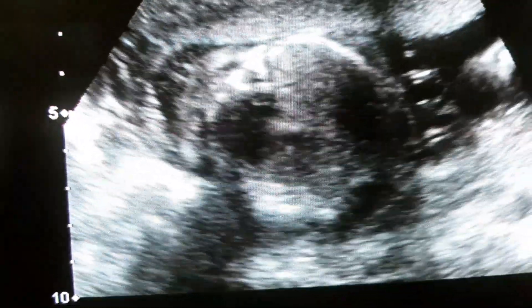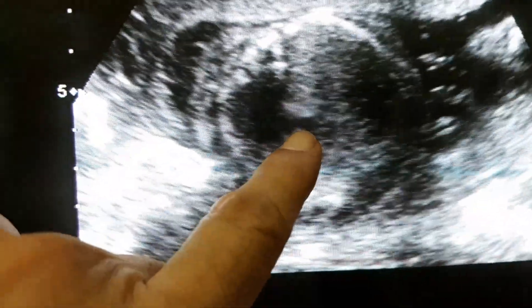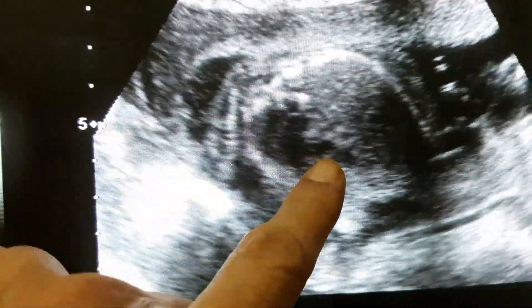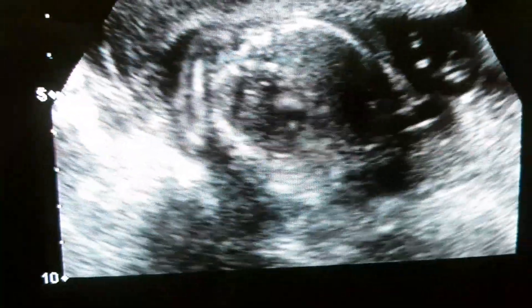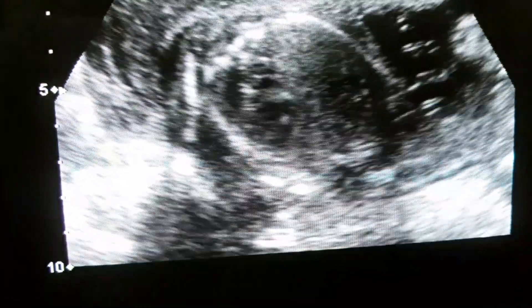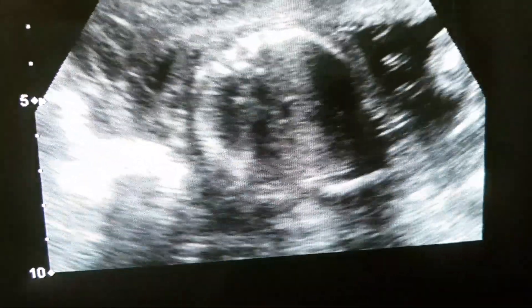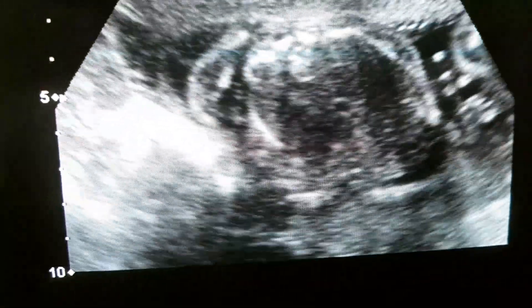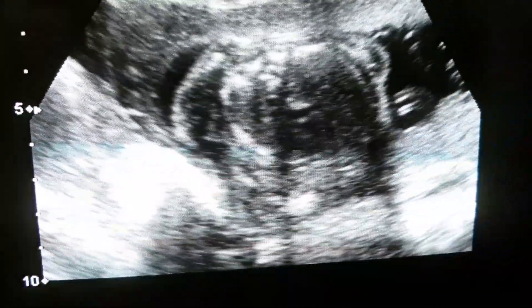It is a very small focus. You should be able to appreciate this. This is the spine. It is in the left ventricle. Can you see it clearly? This is the echogenic cardiac focus. We couldn't detect any other abnormalities.